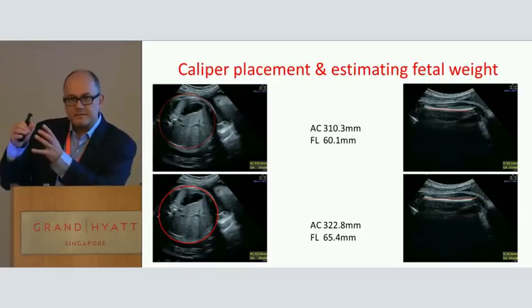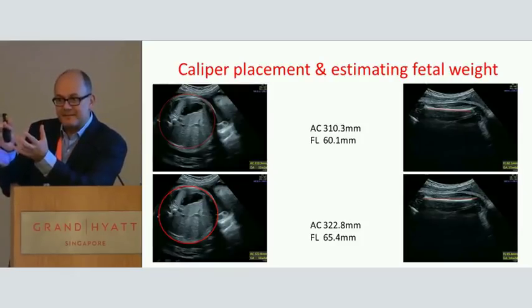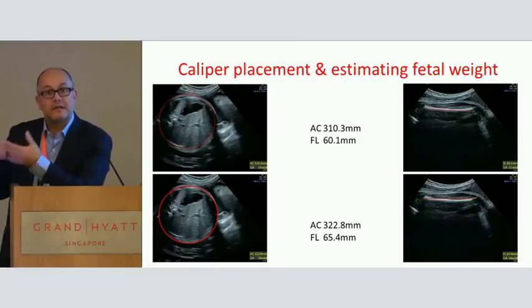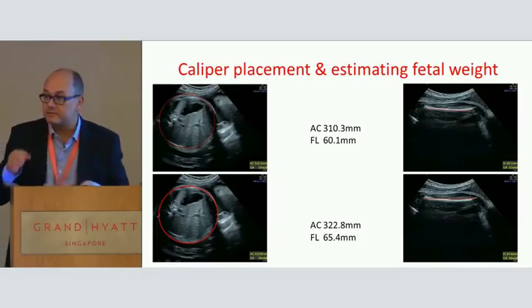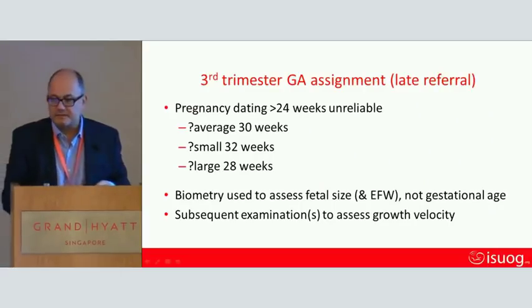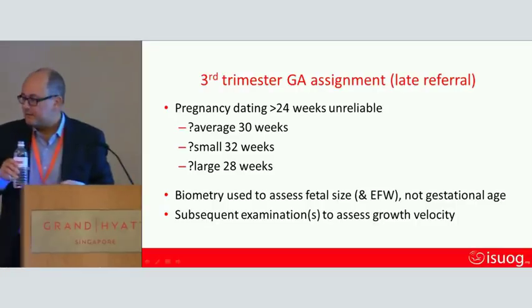So one error is inbuilt in the fact that you're using a formula, but another error is our accuracy and our care when we take the measurements. So please do be careful when you take the measurements, especially for estimating fetal weight.